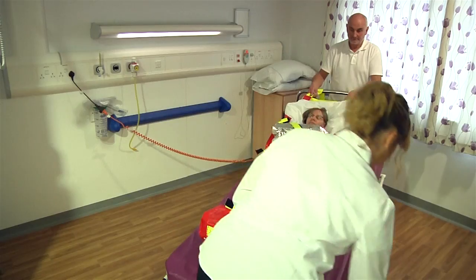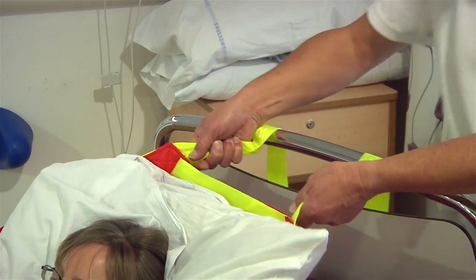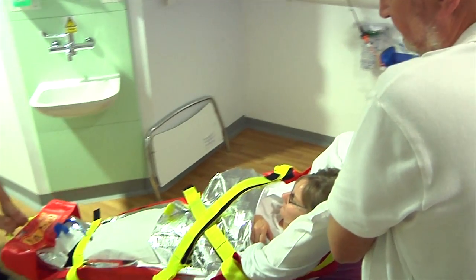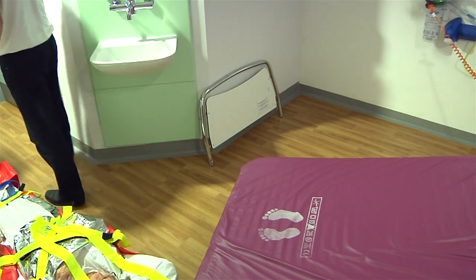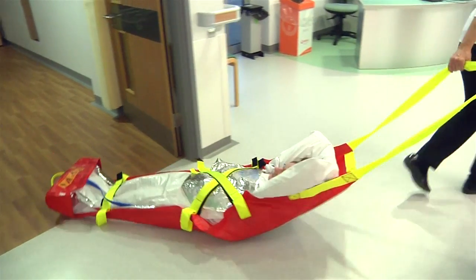The patient is then pulled off the foot end of the bed. Make sure to protect their head throughout this procedure, particularly as the head comes off the end of the bed. Once the AlbacMat is on the floor, both operators should pull it from the head end with the long pulling handle.